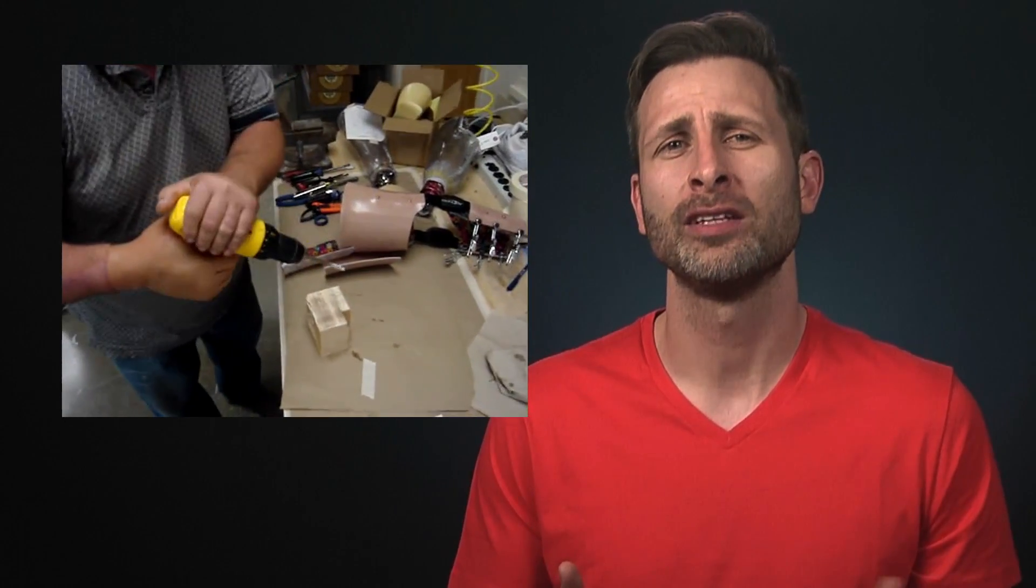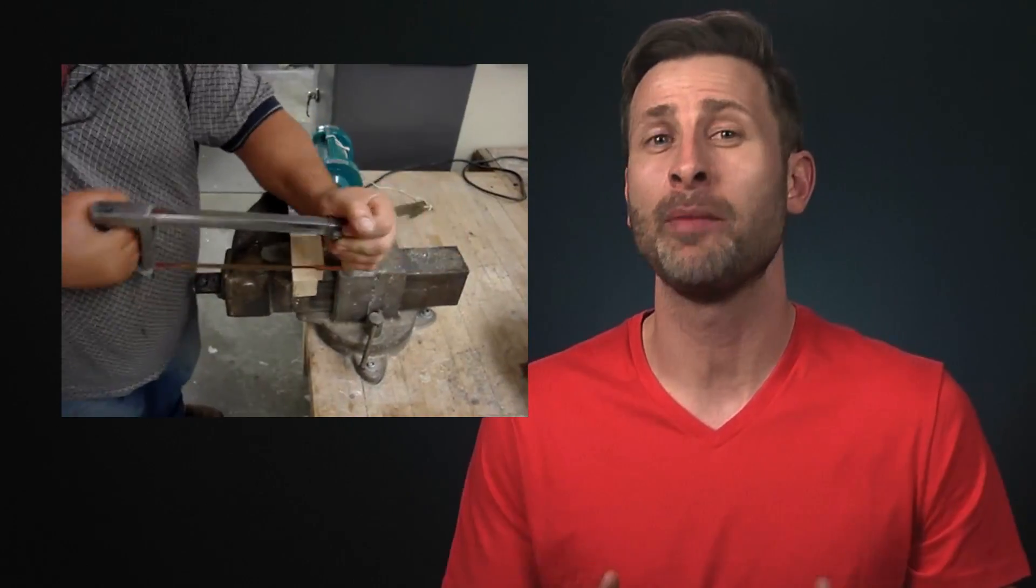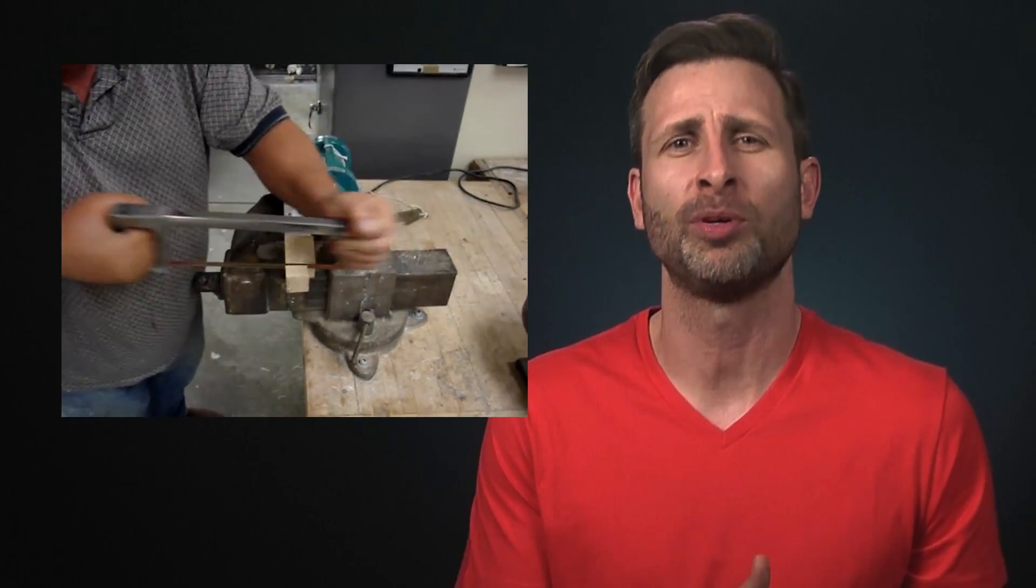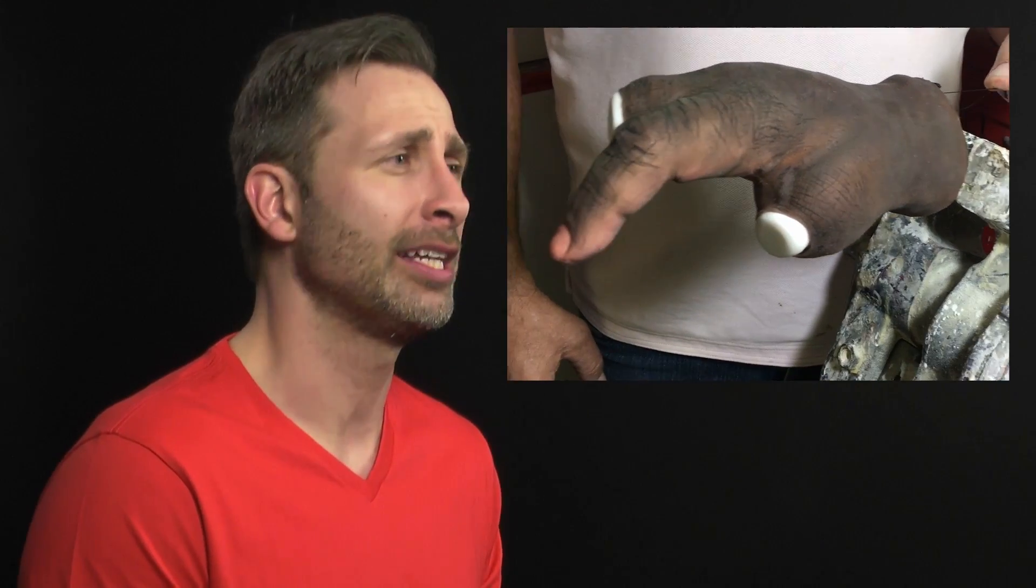For partial hands, function means being able to grasp and hold objects securely. This can be created by making functional grasp positions in the prosthesis or by even adding mechanical elements that allow for movement.